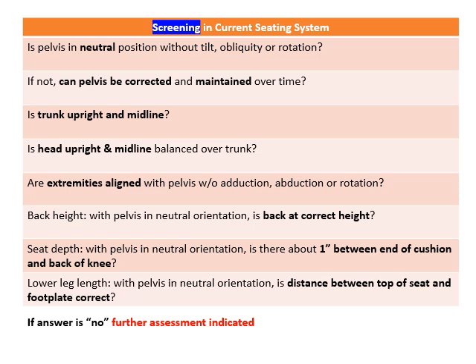If the pelvis is not in a neutral position, can it be corrected and maintained over time? Is the trunk upright and in midline symmetrical? Is the head upright and in midline? Is it balanced over the trunk? Are the extremities aligned with the pelvis without adduction of the femurs or abduction of the femurs or rotations?